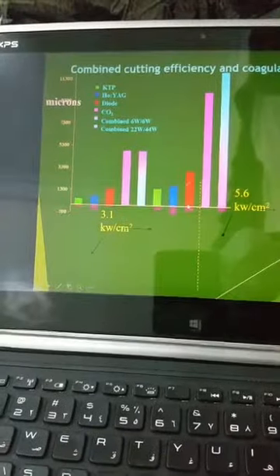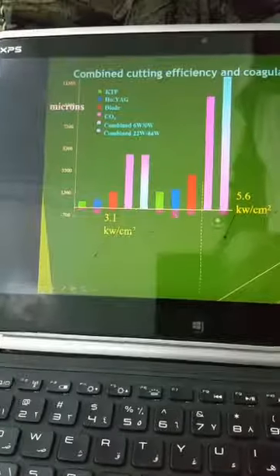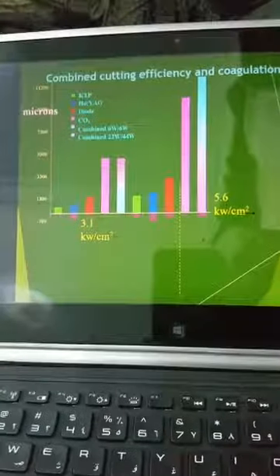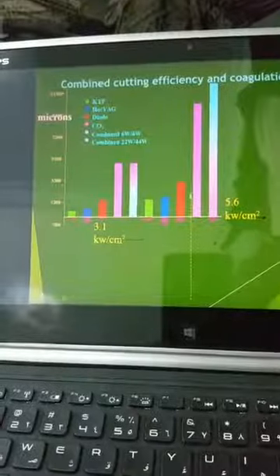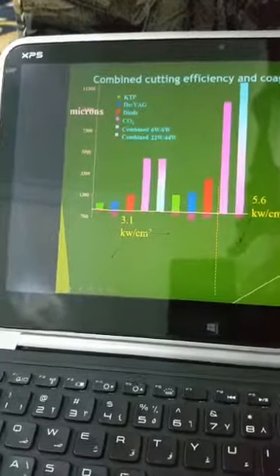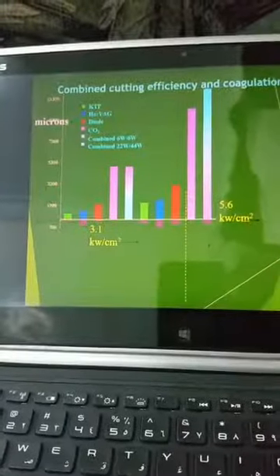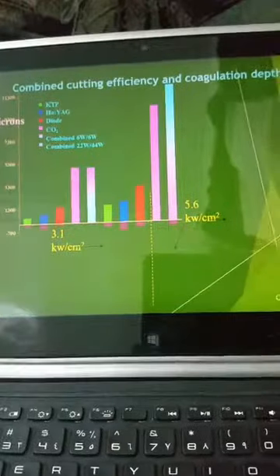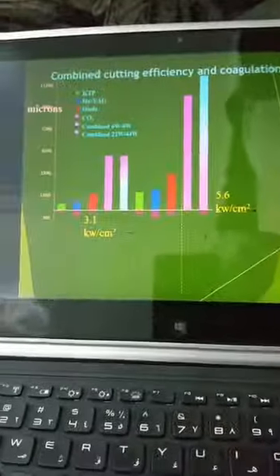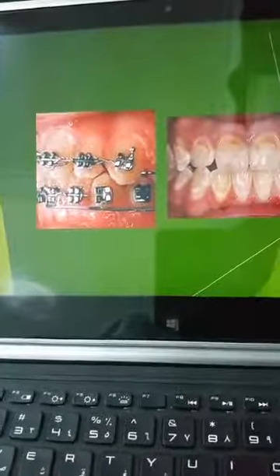It can cut with high power and with low power, but the coagulation here is less compared with the Holmium laser, and blood coagulation is almost minimal. So the healing with CO2 is beautiful, with less scar, or almost no scar that you can see in the oral cavity. It's also very used in skin resurfacing and the fractional laser. The most powerful in coagulation is the Holmium, and it is very, very dangerous in the oral cavity. We have to be careful about the lingual nerve, and if you're dealing with surgery in the floor of the mouth, you might seal the salivary gland ducts if you are not careful when using the Holmium laser. And this is published in this book, 2001.